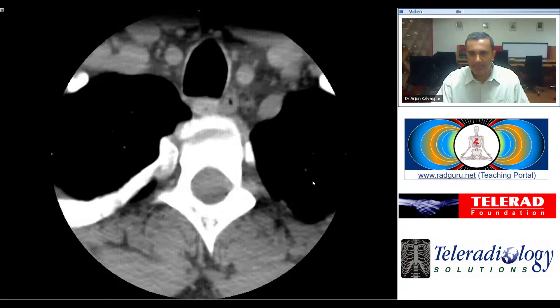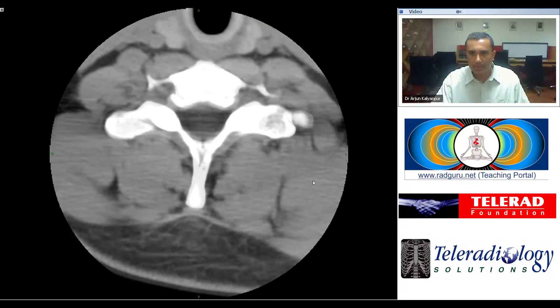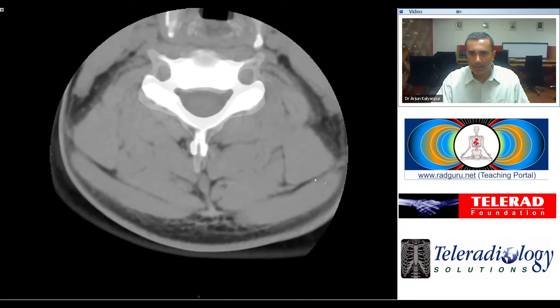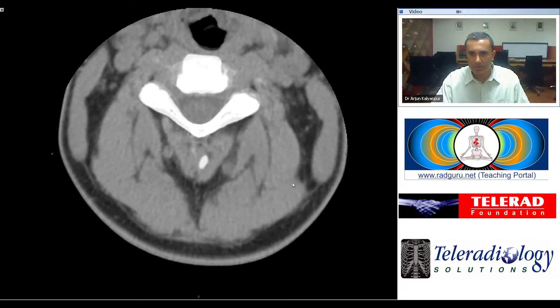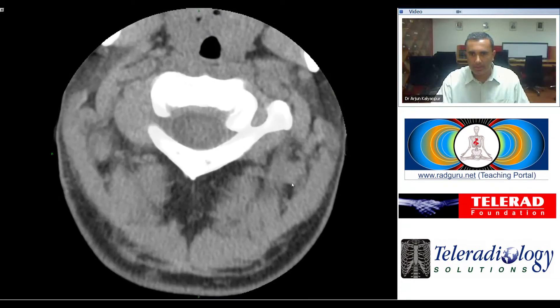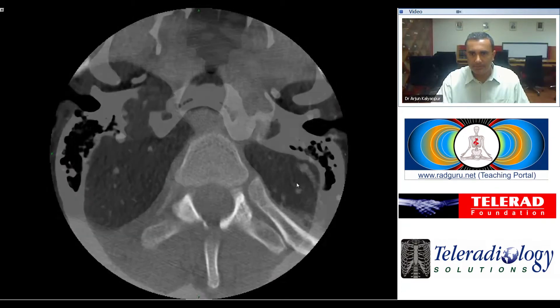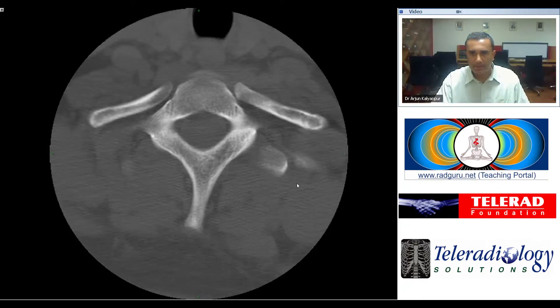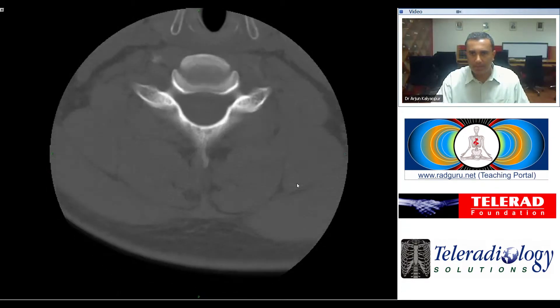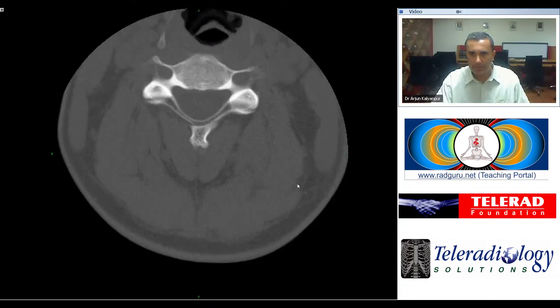So typically, if we begin by looking at the axial images, when we scroll through this particular set of images, it's very hard to pick up an abnormality. Everything looks pretty normal.